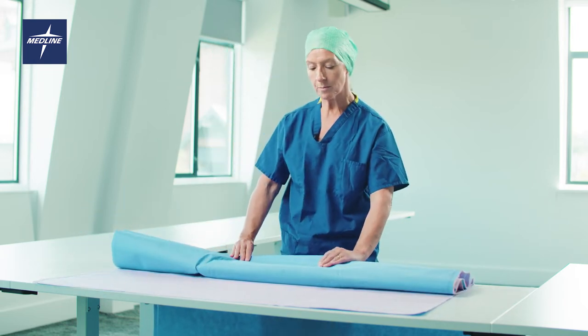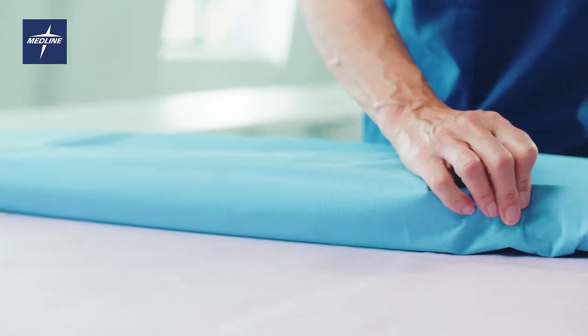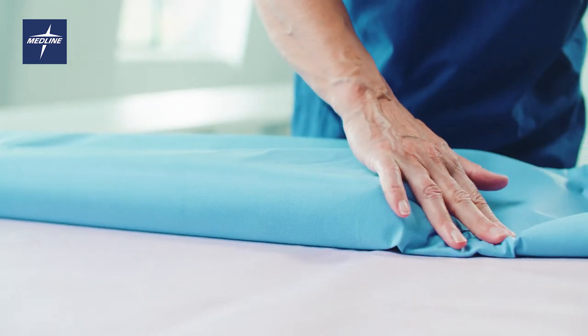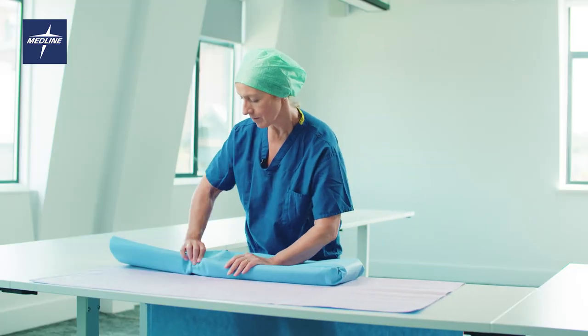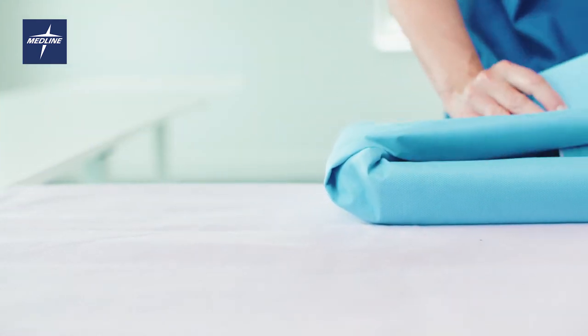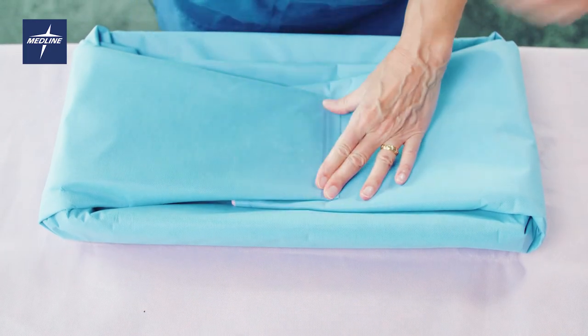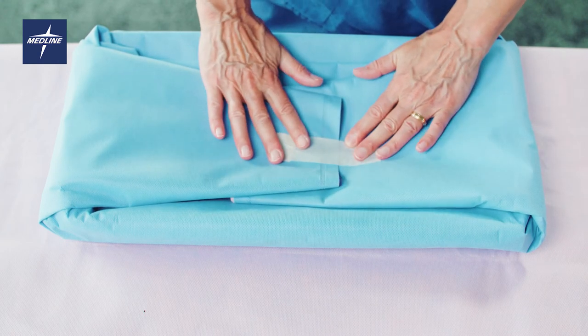Fold to completely cover the set. Fold in the edges into a triangle, and then fix with the appropriate fixings.